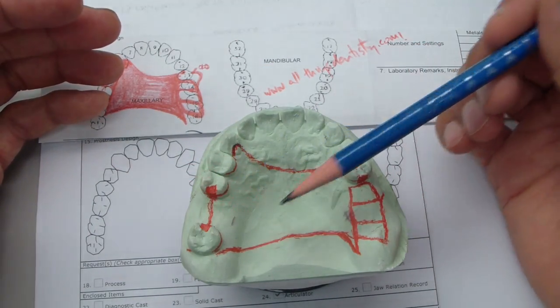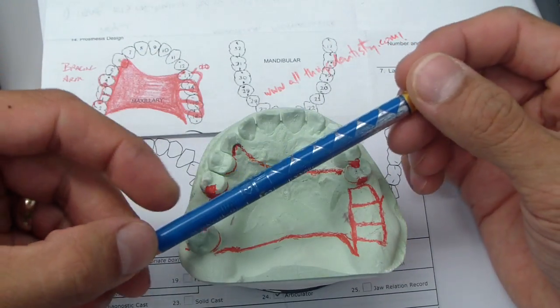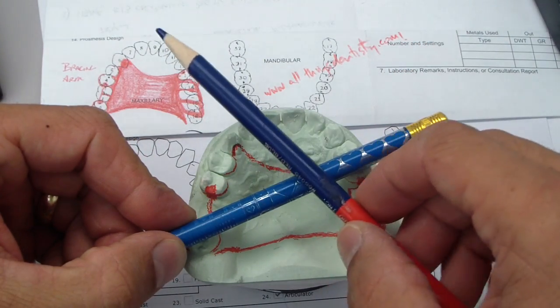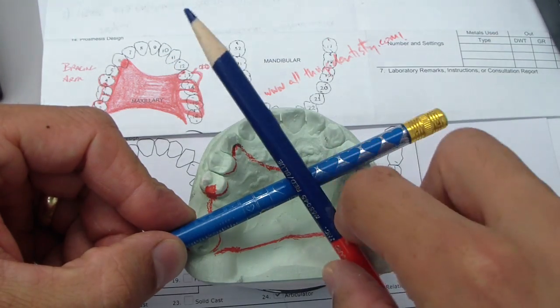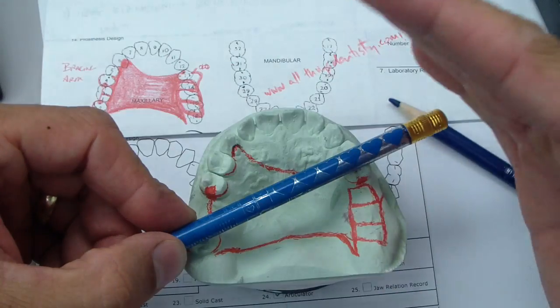Now the most posterior rest seats will be right here, which creates our fulcrum. So essentially you've got a type 1 lever, or the sexy name type 1 lever, or essentially a seesaw that's going to be back and forth when this patient's partial is in her mouth.